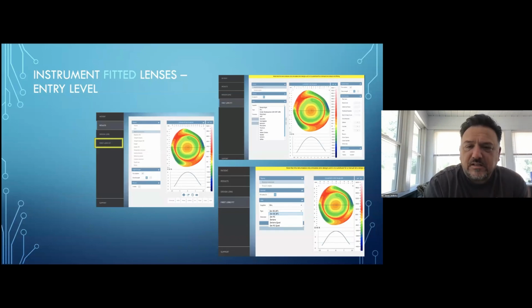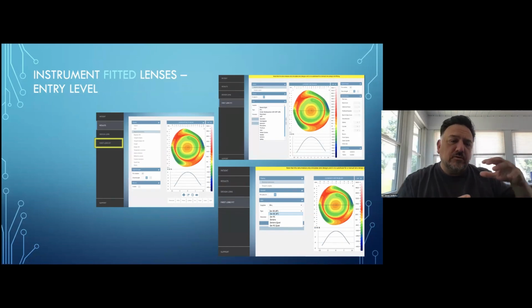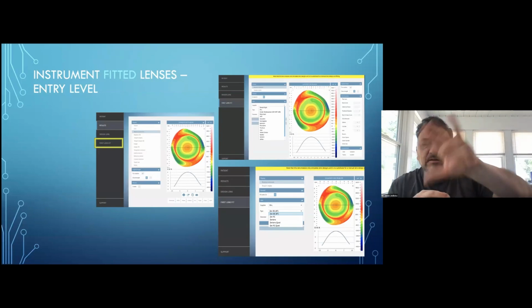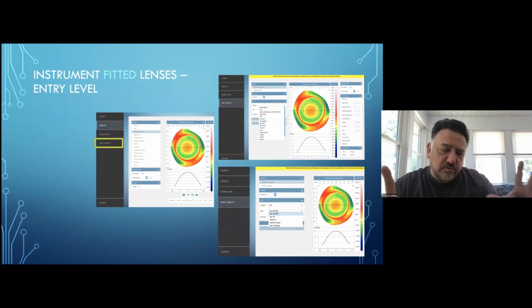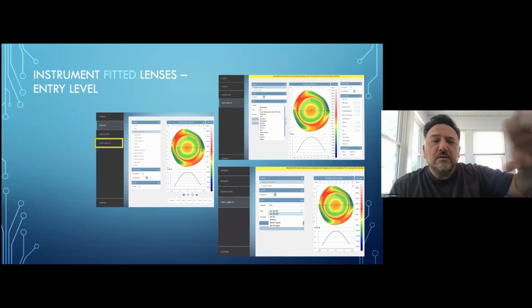And you're basically just getting lenses, again, that you could get out of a diagnostic set. And so when we go through a process like we look at here, where we choose a lens based upon our topography, we go to our first lens fit, and it gives us options. We choose the lens we want to fit, et cetera. We still have to think about the lens we want to fit. We have to think about the diameter we want to fit. And then we let the instrument give us, again, the sag, the toricity of each of the quadrants, for example, specifically, and so on. And if we trust our map well enough, we could go ahead and order that, provided we already knew the prescription parameters that we were going to need.